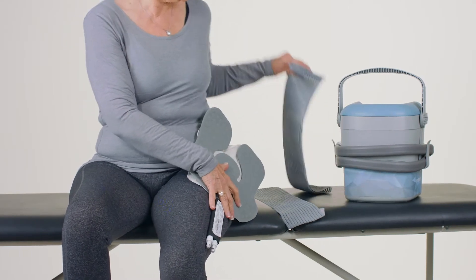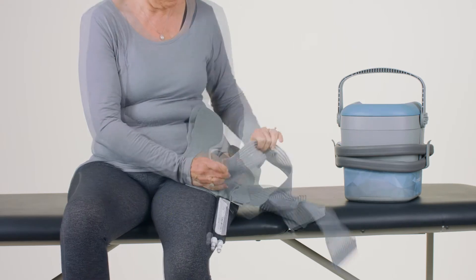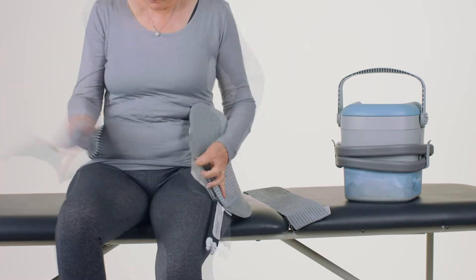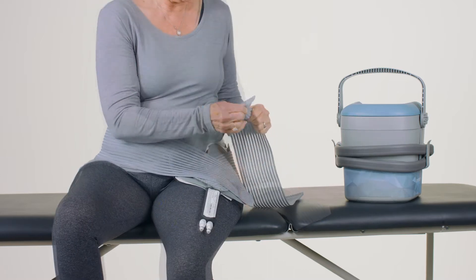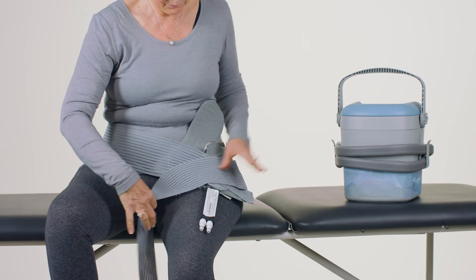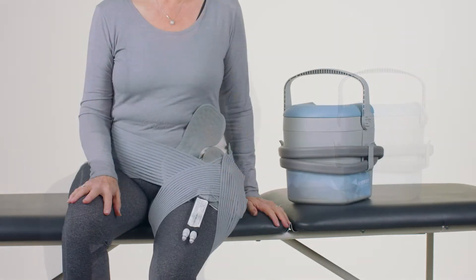Use a thin layer of dressing or a barrier when applying the pad to the area being covered. Apply the cold pad to the hip with the hose extending down the leg. Position the long elastic strap around the hips, securing it to the front and back. Position additional straps around the leg.